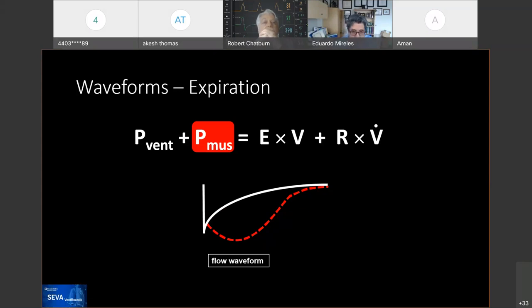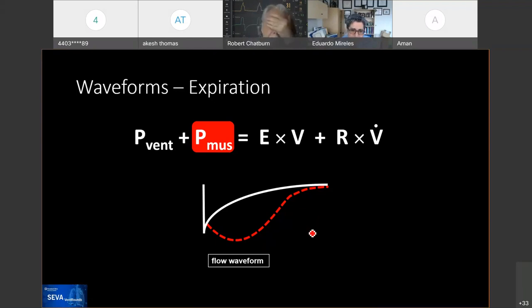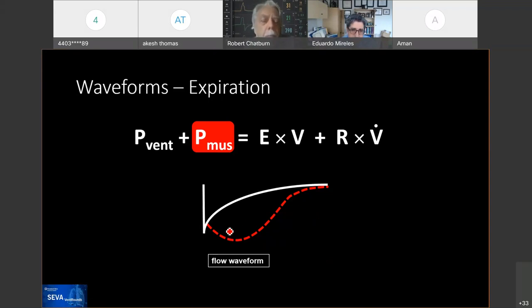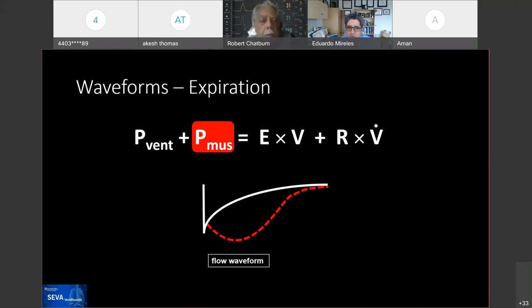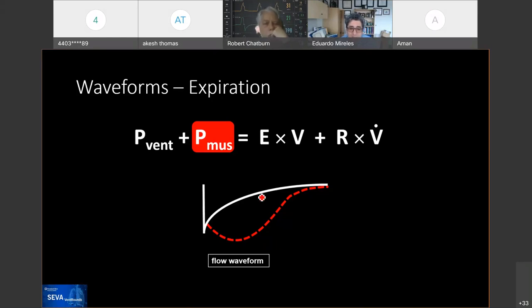Rob comments: all of these distortions in the pressure, flow, and volume waveforms are arbitrary because P-mus can have just about any shape imaginable. But the general direction and general trends shown are what you have to keep in mind. There's no normative way that the diaphragm contracts or the respiratory muscles look, and it can happen at any phase of the inspiration or expiration. That's the cool part — just keep that in mind.